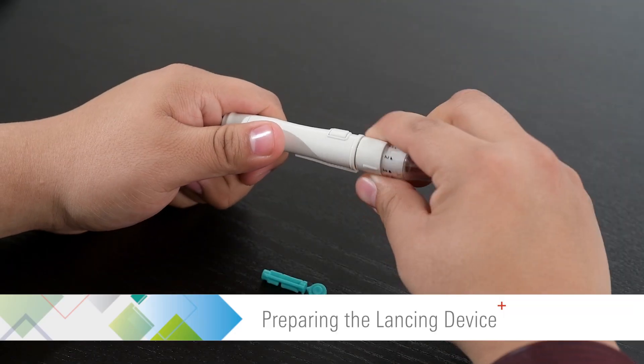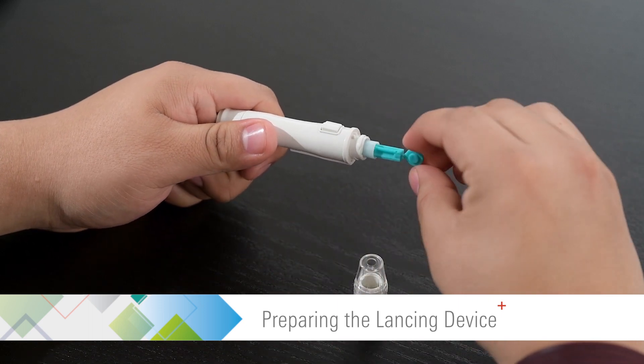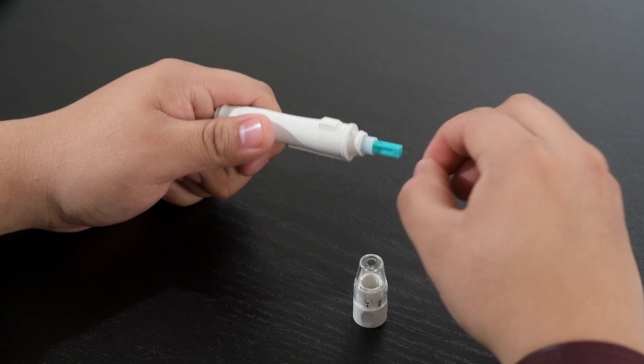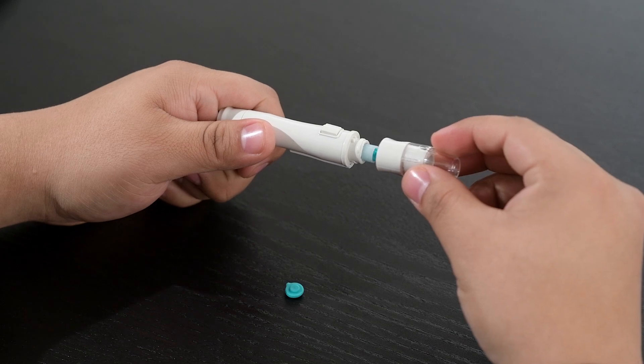Unscrew and remove the adjustable cap and insert a new lancet into the lancet holder. Twist off the protective cover of the lancet and set it aside. Screw back on the adjustable cap.